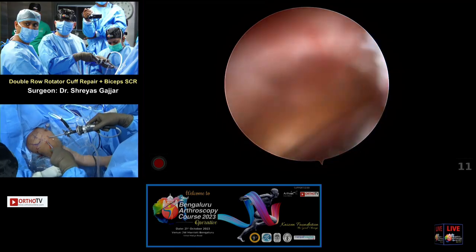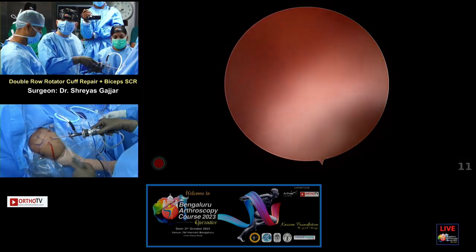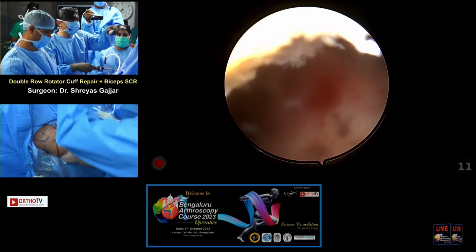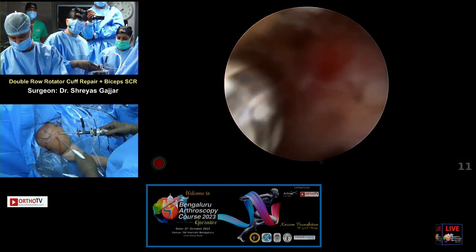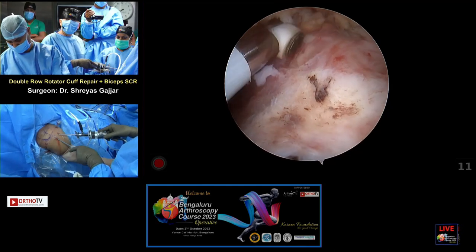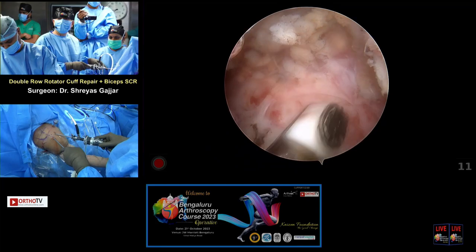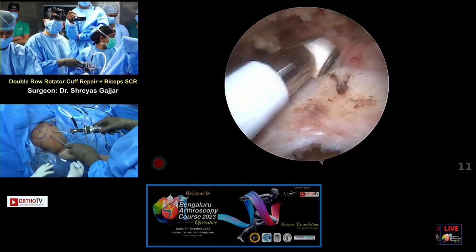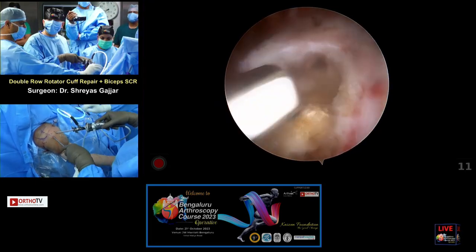I already did that on the subscap side. I'll just try and do that on this side. So can I have the burr, please? Sorry, if you're using a double row repair, you would still use a knotless anchor on the medial side? Knotless anchor on the medial, yeah. Again, it depends on what you are comfortable with and what the budget for the surgery is. But I do the speed bridge technique, so I use the knotless medially and laterally.